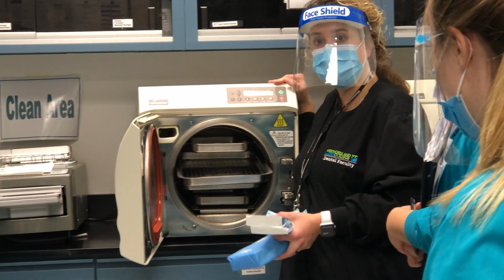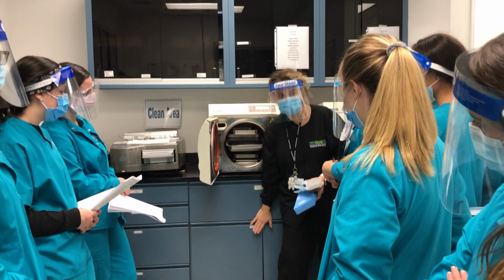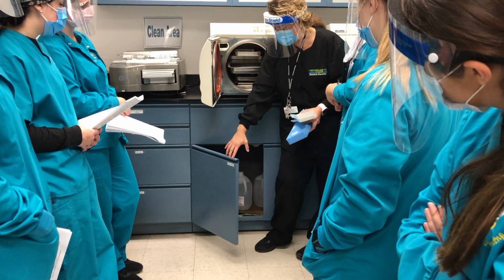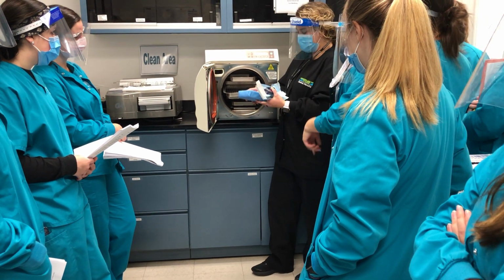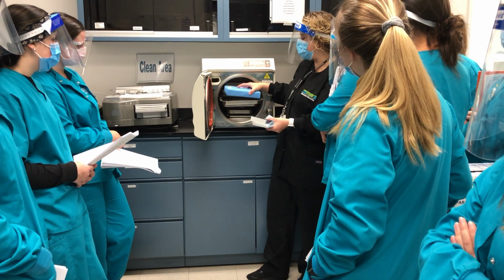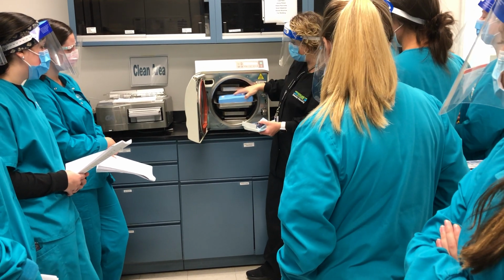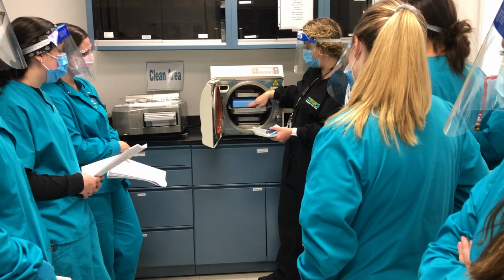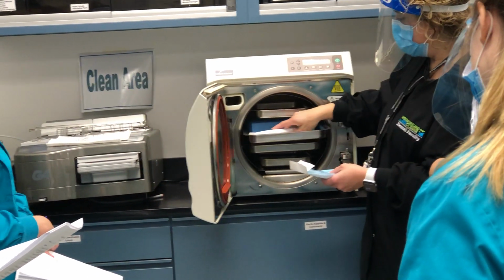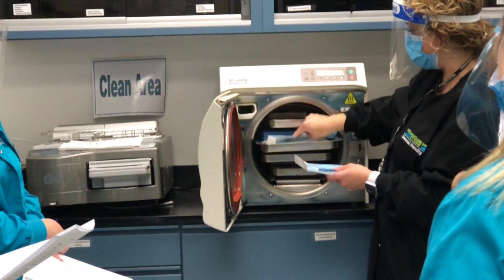And can I put regular water from the tap in here? No, distilled, and that is right below us here. So if you would ever come across, you're gonna have distilled water in your office, that is what you add to your autoclave. And then you're gonna put this in, like Miss Eustache said, with the tape facing up. So when we open the autoclave, we see that the tape's facing up and it's been autoclaved, that the process has happened. And then the paper side is up when we place these items.